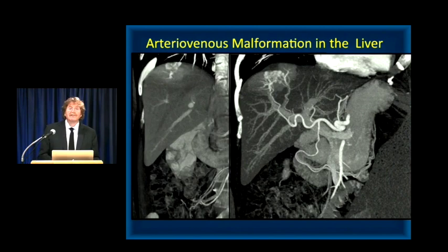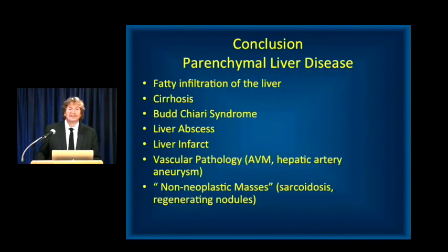So I've gone through a number of different conditions. Here's just some of them I've spoken about. I've tried to highlight some of the pearls and some of the pitfalls, shown you a number of examples, discussed the potential importance of each of the diagnoses.